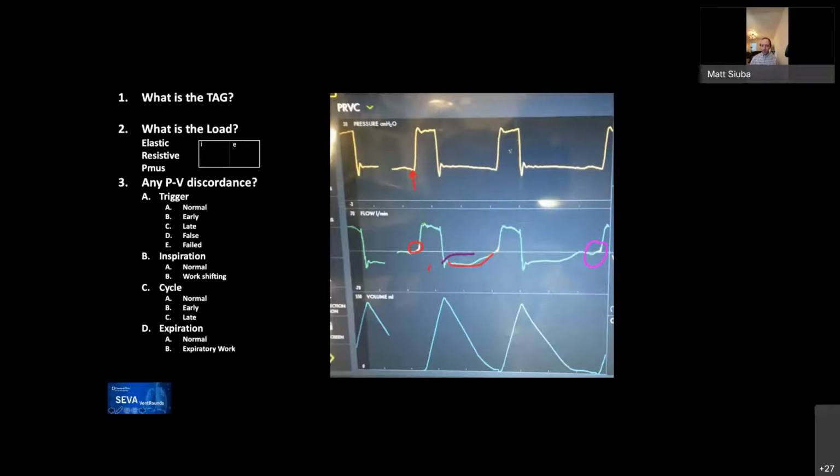There is some work being done in inspiration as well, because in a pressure controlled breath, a passive patient would have exponential decay of the breath. It's usually a little bit flatter in PC-CMV than in PC-CMVS, but it would still be there. So the fact that it's moved in this direction suggests that the patient is doing some work. I think you're right that it's not that much work because in PC-CMV we'd usually see the pressure waveform deflected downwards if the patient was doing an untoward amount of work. So this is probably an acceptable amount of inspiratory work.